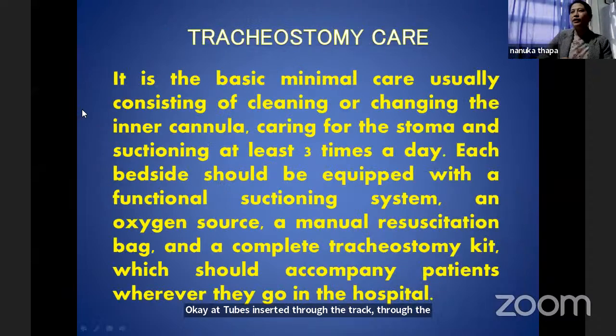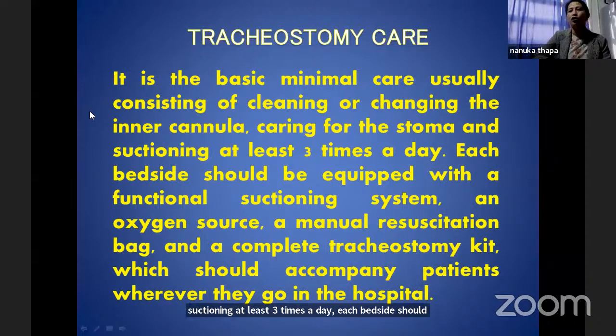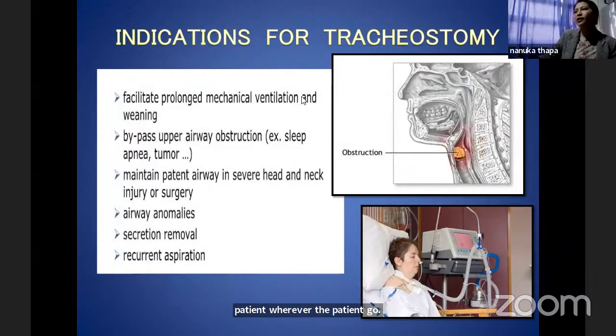So what is tracheostomy care? It is the basic minimal care, usually consisting of cleaning or changing the inner cannula, caring of the stoma, and suctioning at least 3 times a day. Each bedside should be equipped with a functional suctioning system, an oxygen source, a manual resuscitation bag, and a complete tracheostomy kit, which should accompany the patient wherever the patient goes in the hospital. So what are the indications for tracheostomy? What I said before, right?